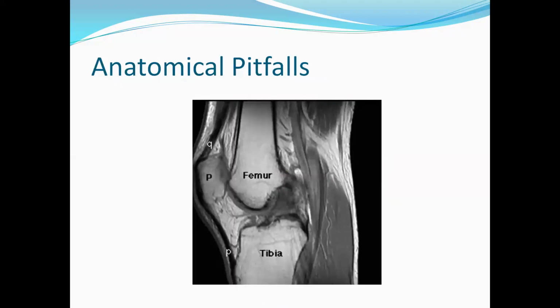In the MRI finding, you can see there is a lot of fat pad in the anterior area when going for an intra-articular injection from the front. So if you have not gone deep enough, if you have not aspirated the joint, you have not collected the joint fluid, you are likely to deposit the steroid or anesthesia inside the fat, the infrapatellar fat pad in the anterior part of the joint.